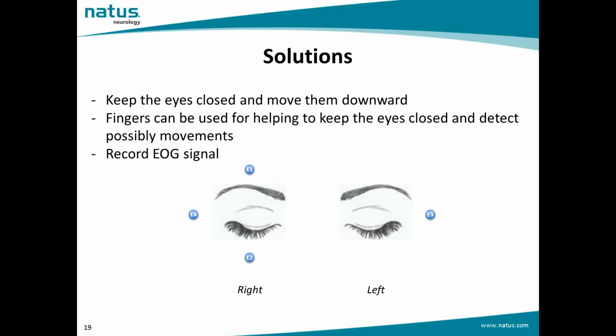Anyway, in order to detect ocular artifacts and distinguish them from possible EEG slow waves, dedicated electrodes for recording the electrooculogram are required and should be inserted into the montage. We can use different montages according to the availability of free channels on the amplifier.